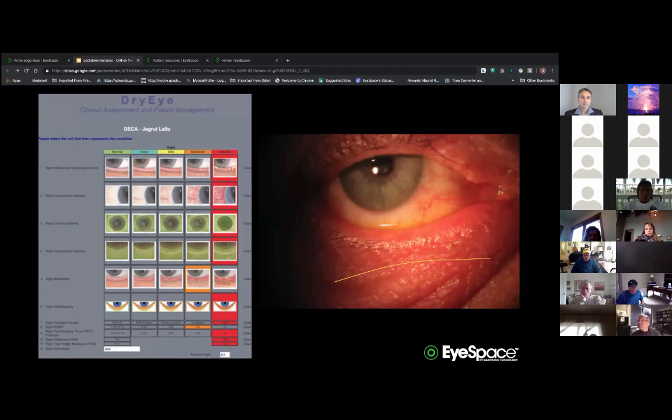So there are probably types of dry eye where it would be a no. I'm talking about the very severe end of the scale, where you'd need to do a lot of treatment before you go in. In some cases I've had patients where we'd have to do LipiFlow and an IPL, and then we start the orthokeratology treatment.